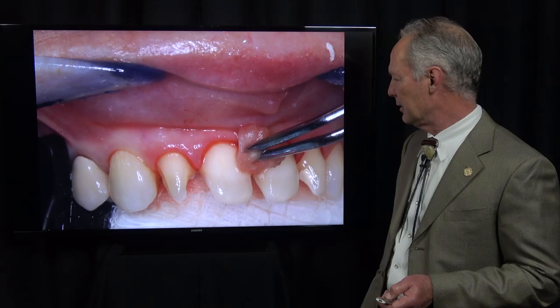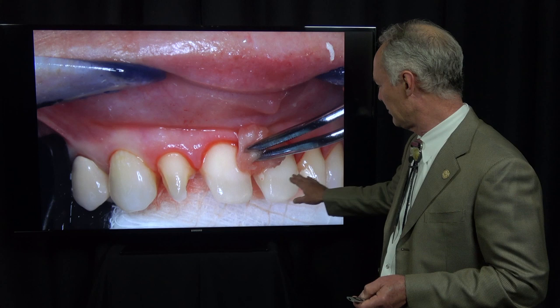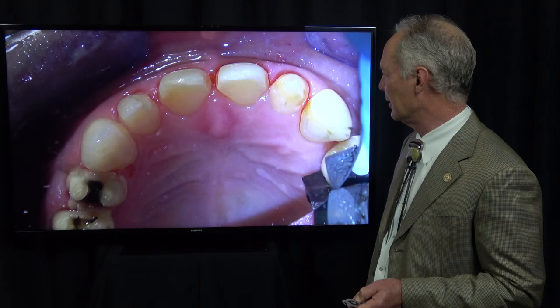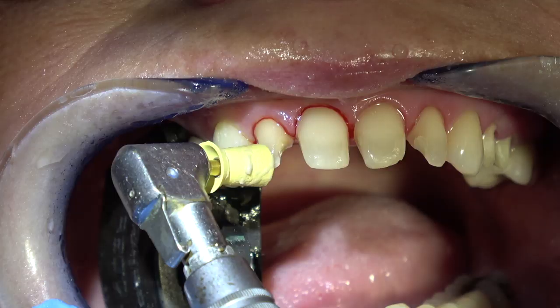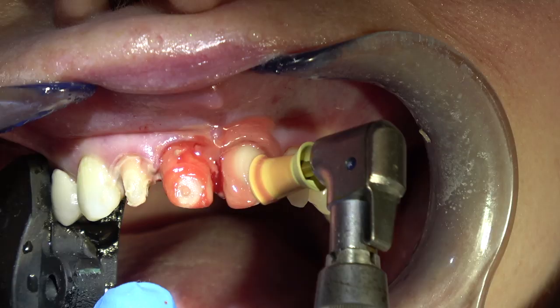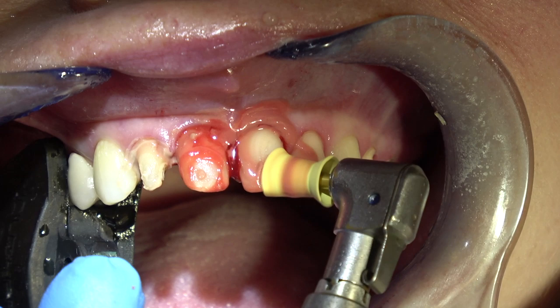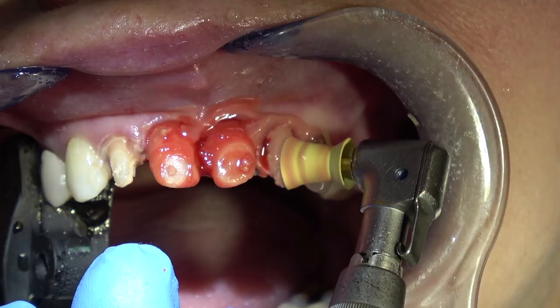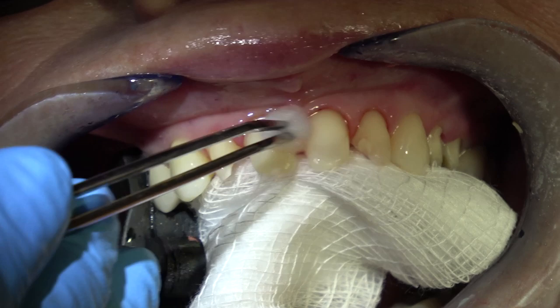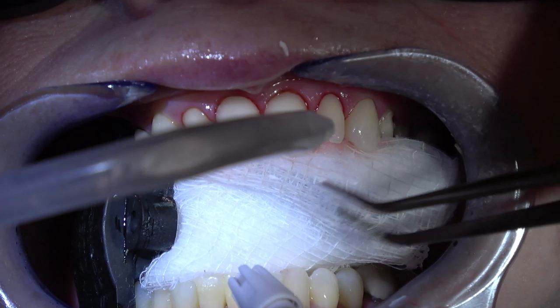So then I'm just lightly reprepping that part and then polishing them with pumice and water, and then wiping them with isopropyl alcohol just to clean everything off. This is pumice and water, and then isopropyl alcohol. Rinse that off. Then here's the isopropyl alcohol. Be sure you put 2x2s in the mouth and then wipe it, clean everything off.